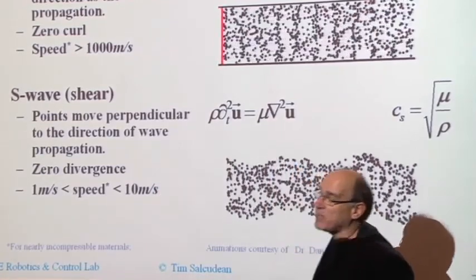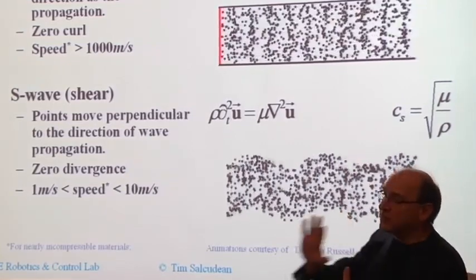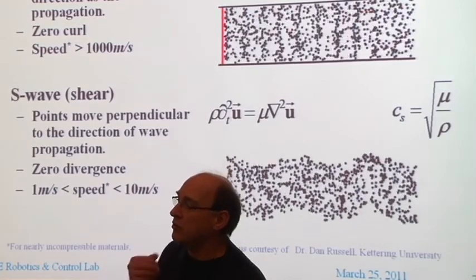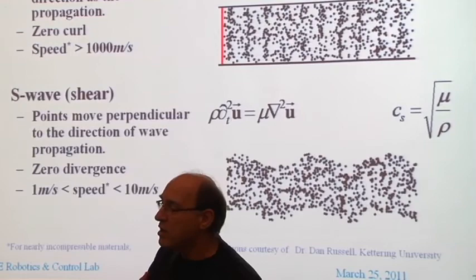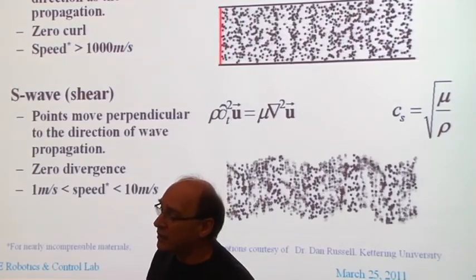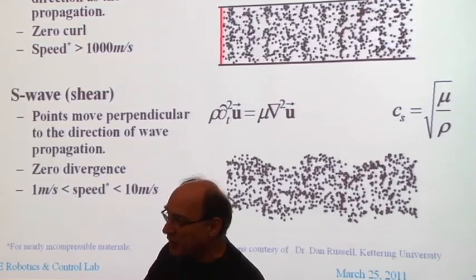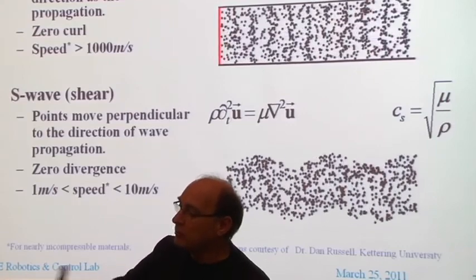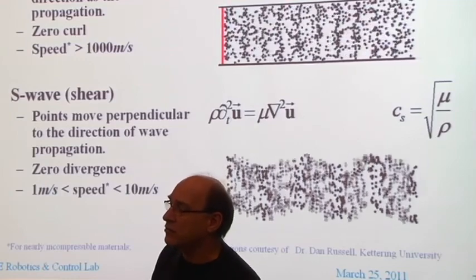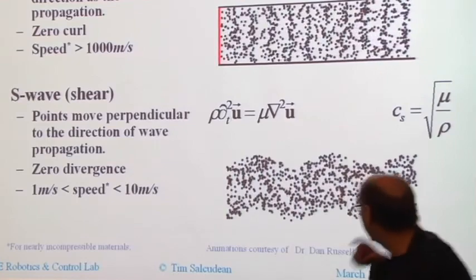So depending on the boundary conditions, in fact, you can have a wave that travels at 1540, which is the first shock when you apply the impulse to tissue, followed by a slow wave, which goes around 10 meters per second. So you can repeat your echoes to actually follow the wave that you sent first. The physics of it is actually quite beautiful.